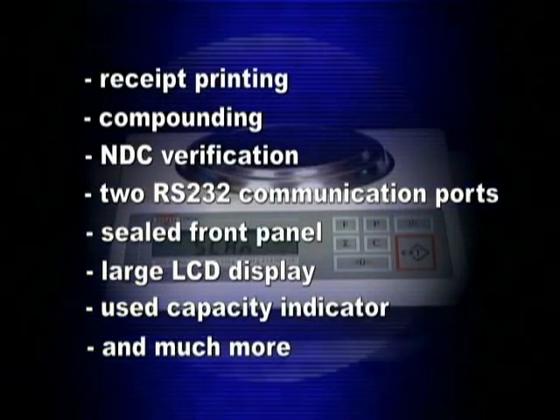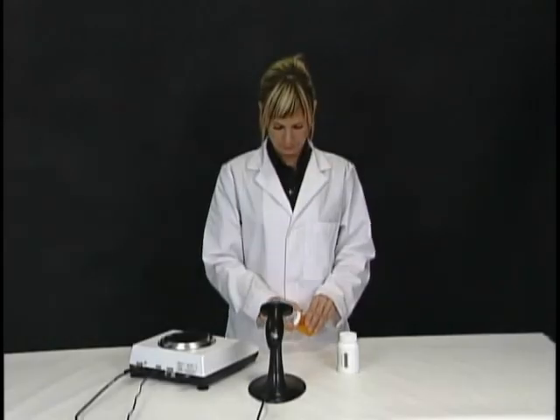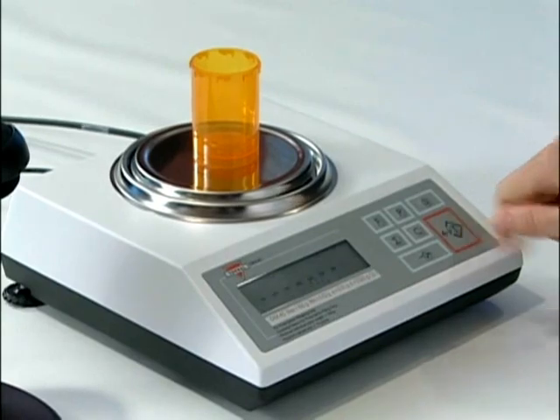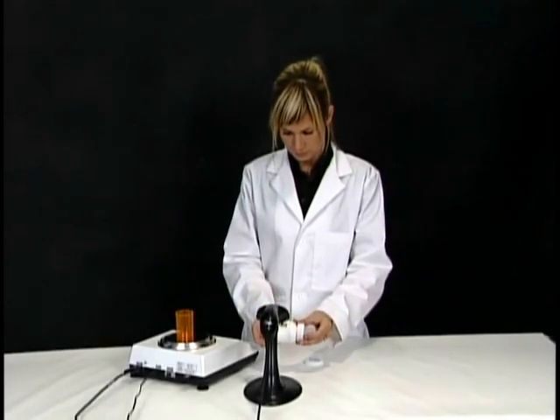Pill counting with the DRX-4C is a simple three-step process. If a drug has been previously stored in the scale's database, simply place a vial on the pan and tare it by pressing the T key. Then scan the barcode located on the supply bottle.